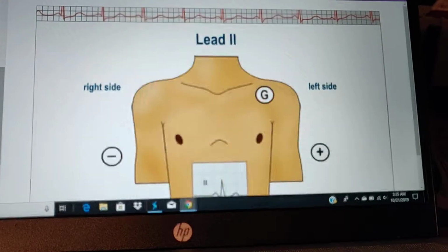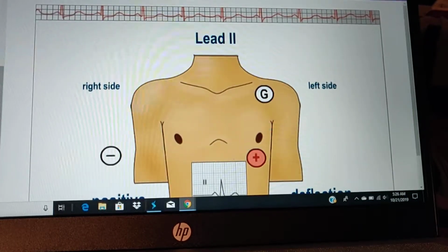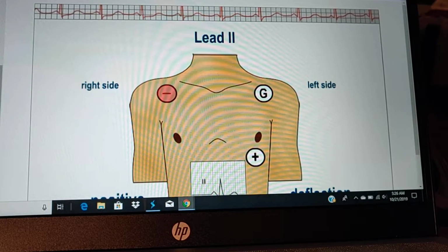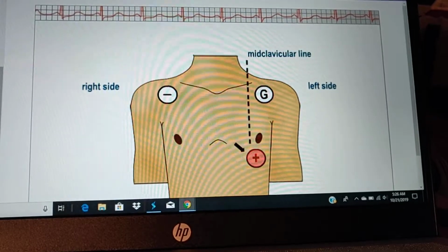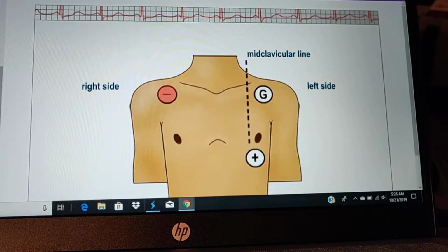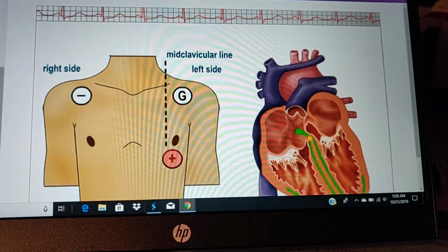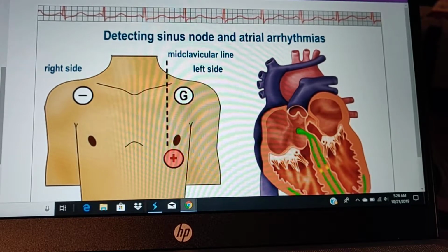Lead 2, one of the most commonly used leads, also produces positive deflection. The positive electrode is placed on the patient's left leg and the negative electrode on the right arm. When a leg placement is indicated, that means to place the lead on the torso above the waist, not actually on the leg. Place the positive electrode below the lowest palpable rib at the left midclavicular line and the negative electrode below the right clavicle. In this lead, the current travels down and to the left following the normal conduction system of the heart. Lead 2 gives us information about the inferior wall of the heart. It is also useful for detecting sinus node and atrial arrhythmias and for routine monitoring.